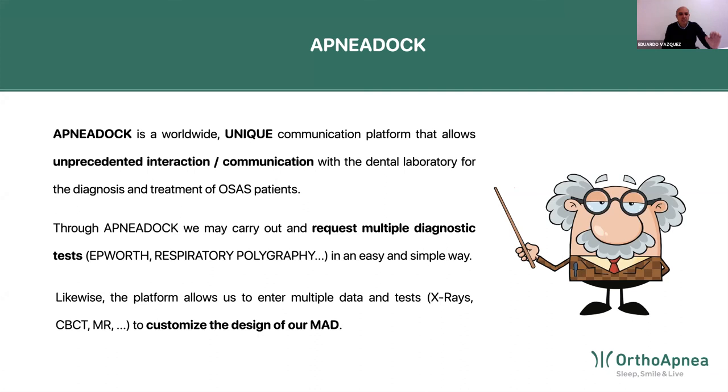Another question is how are repairs taken care of? So for instance, there's changes, crown and bridge work. Do we need to rescan in all circumstances? What is the protocol? Yeah, in general, yes. If changes are small, probably this can be adapted by the lab.